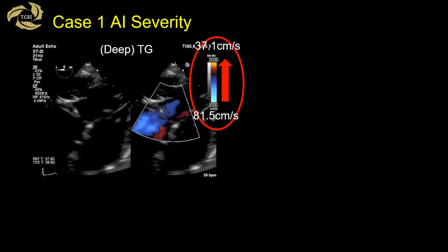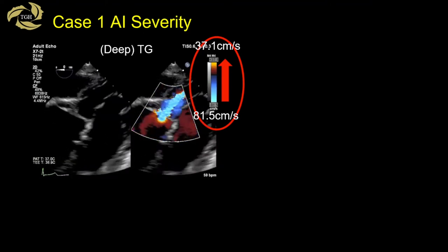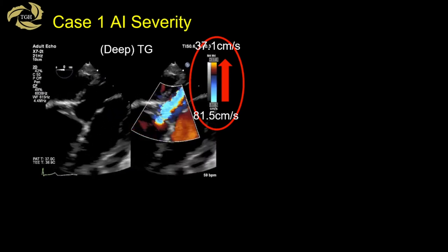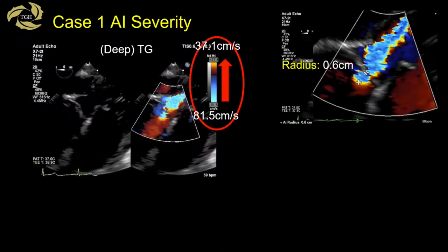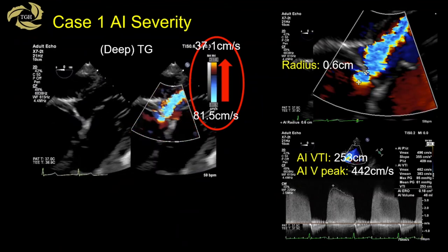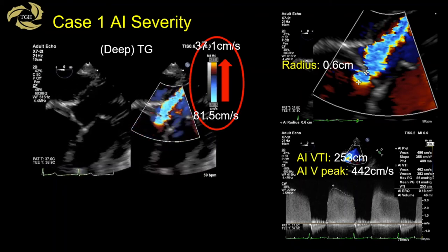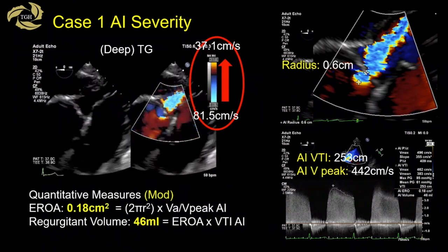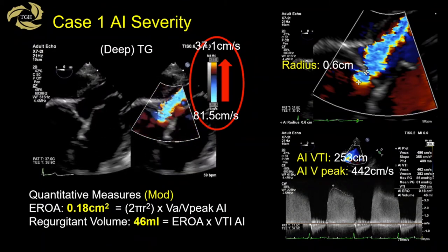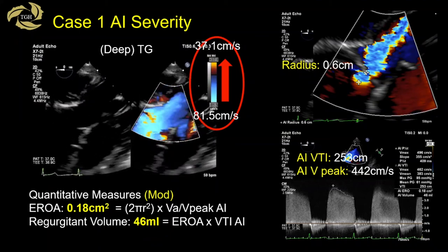A fairly simple additional method is EROA or PISA calculation, performed in the deep transgastric view. You shift the baseline upward to maximize the hemisphere at the flow acceleration zone, measure the radius — which is 0.6 cm in this patient — then trace the AI jet CW recording. Software within the machine will automatically calculate the result. In this patient, EROA was 0.18 cm² and regurgitant volume was 46 cc, suggesting moderate AI.